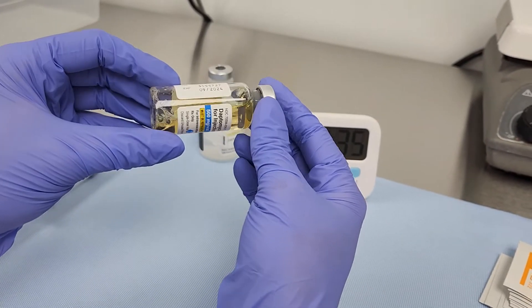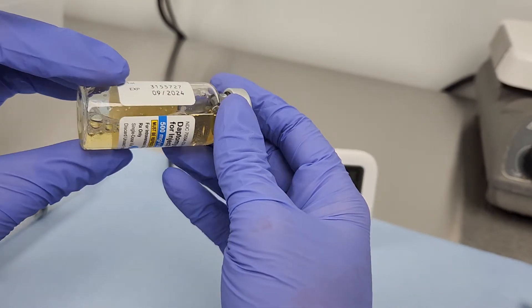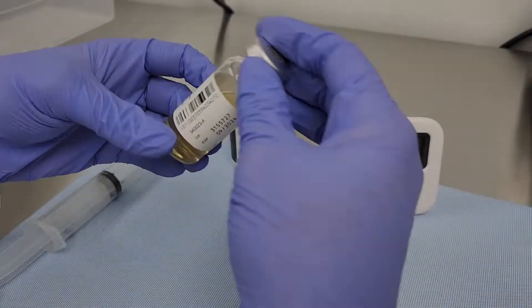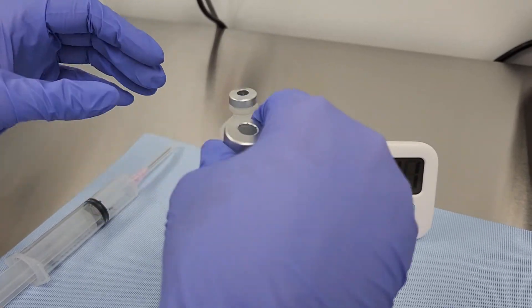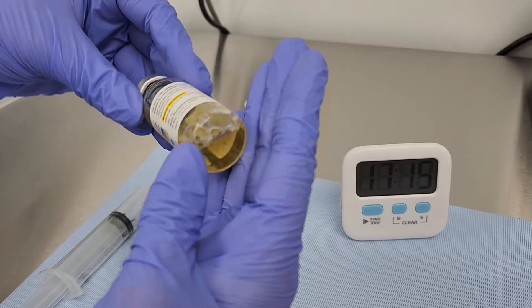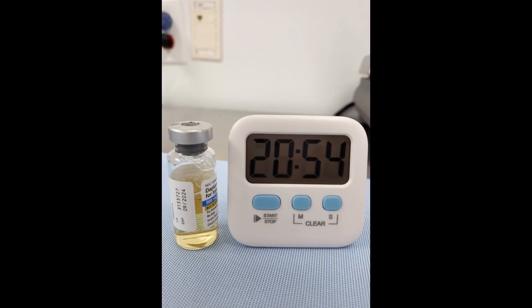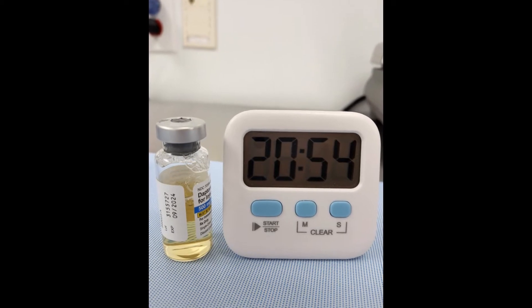Continue this process of gentle agitation in 5-minute intervals. At each 5-minute interval, inspect the vial for remaining clumps of undissolved powder. Total reconstitution time should take no longer than 25 minutes.